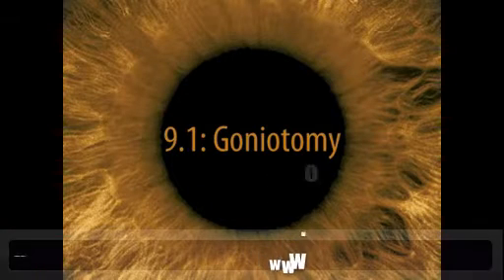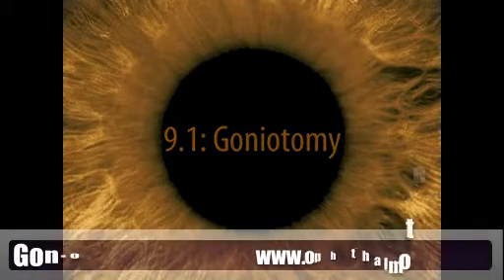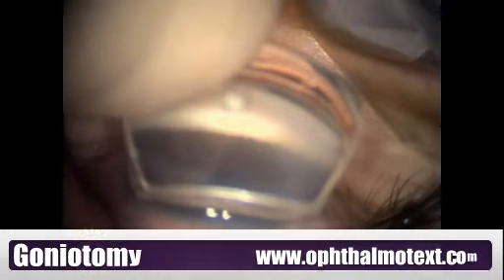This is a video of a goniotomy surgery performed by Drs. Chen and Walton. The patient is a 7-month-old Portuguese boy with infantile glaucoma of the left eye. Here you can see that the assistant has already put the Elschnig-O'Connor locking forceps on the superior and inferior rectus muscles.